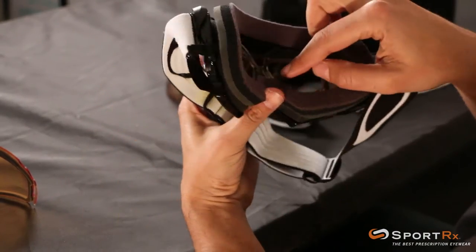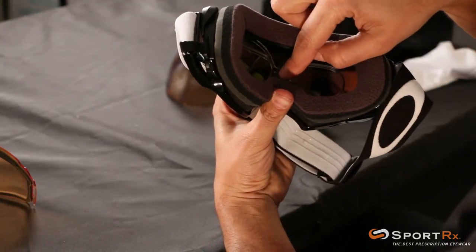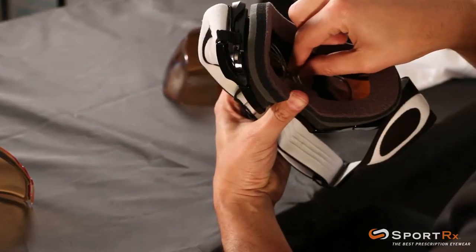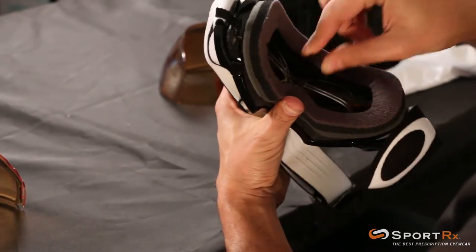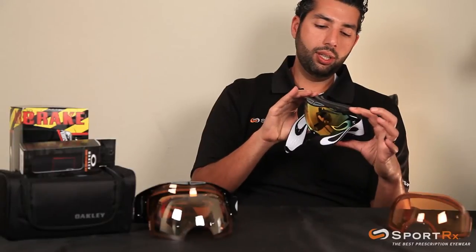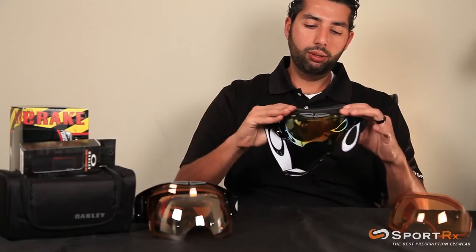Pull down the little springs and boom — the insert's in there. What you really want to make sure you do is get the middle of the insert over the nose bridge so it's totally over that pad, and boom, your insert is in there nice and smooth. It shouldn't fall out; it should stay in place really well.